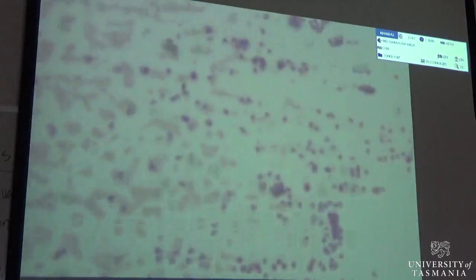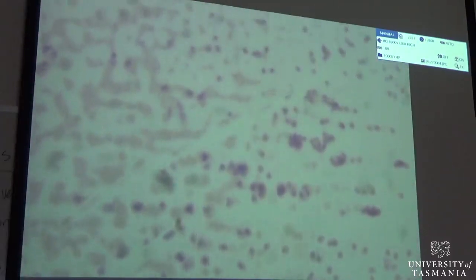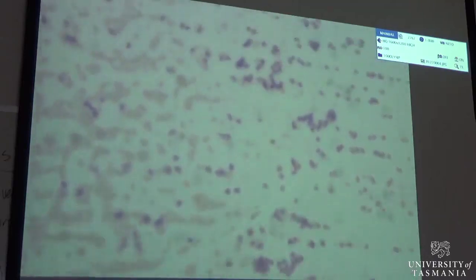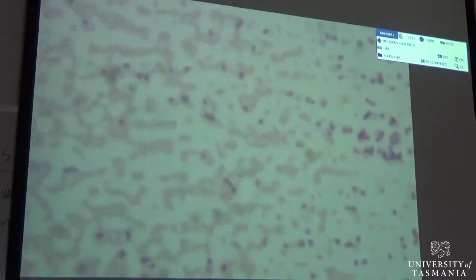And finally, I'll just notice what the time is. So this is film 2.2.1. I'll do the right thing and go down to the 10 times first. So we already have a clinical history of alcoholism. So you can see here how all of these white cells have been caught in the tail here. So that's why you don't do a differential count in the tail.